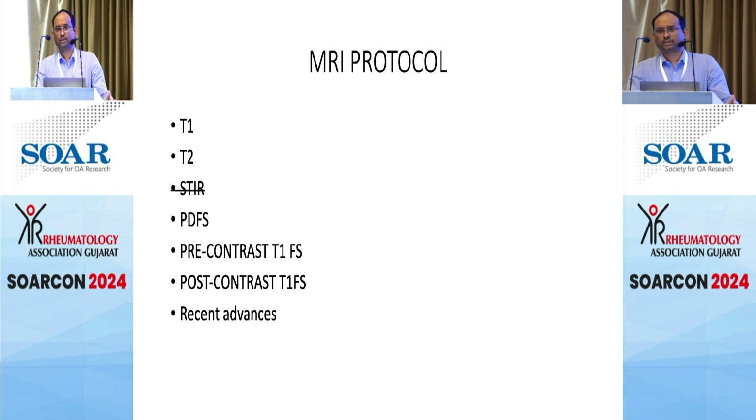Contrast imaging is generally not required in osteoarthritis. We can do away with the contrast, but if we are using contrast, we have to do pre-contrast and post-contrast sequences, and there are some recent advanced sequences which are now being developed.